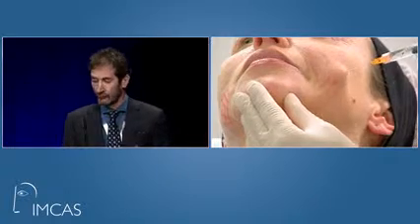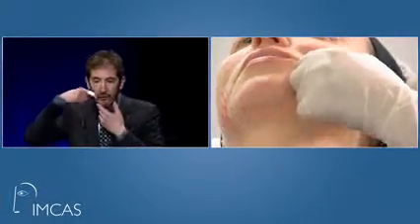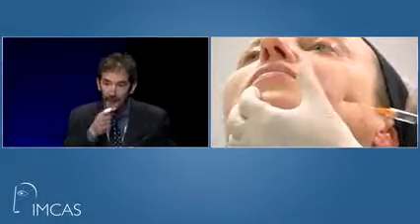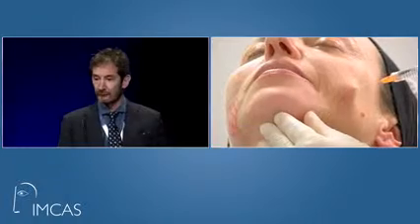Then it's a matter of how you do this. I think your technique is a little interesting in that you're crossing an area that you have to be subcutaneous because the buccal sulcus comes inside here, and if you're not immediately subcutaneous, you'll put this into the mouth. When I fill this area, I like to use a more inferior approach right down onto the bone. That's my preferred method and technique. But I think there are a lot of different ways to do this.